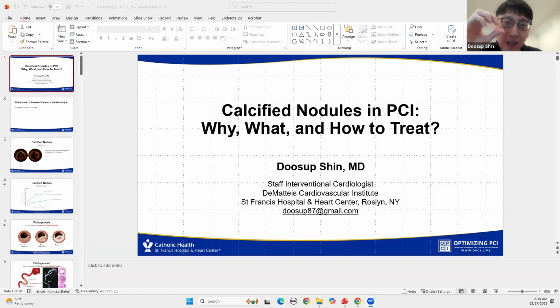So maybe use advanced angiography tools if you have them, place the emitters around that area, and move a little bit forward or backward to maximize the effectiveness of IVL.